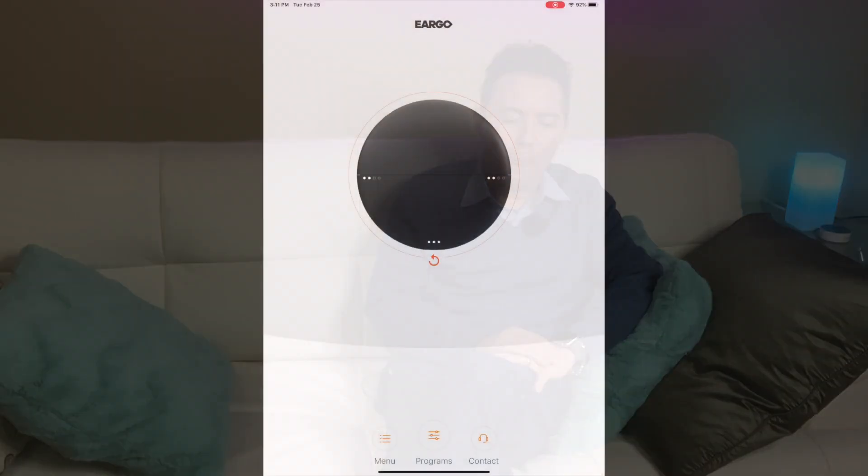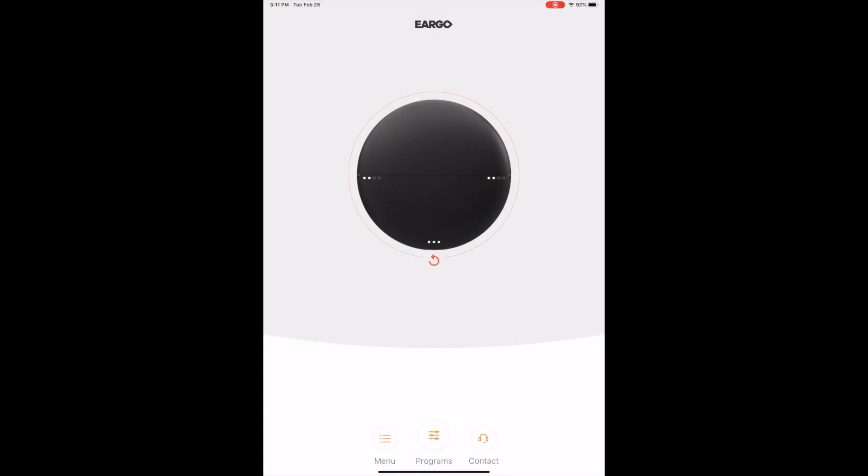And then once I get done with that, we'll come back for some final thoughts. Okay, so here's the app interface when you open it up. Pretty simplistic. It has the device showing that it is connected. If I hit this it's going to circle until it finds it. Of course it did find the device, so we are connected to it.